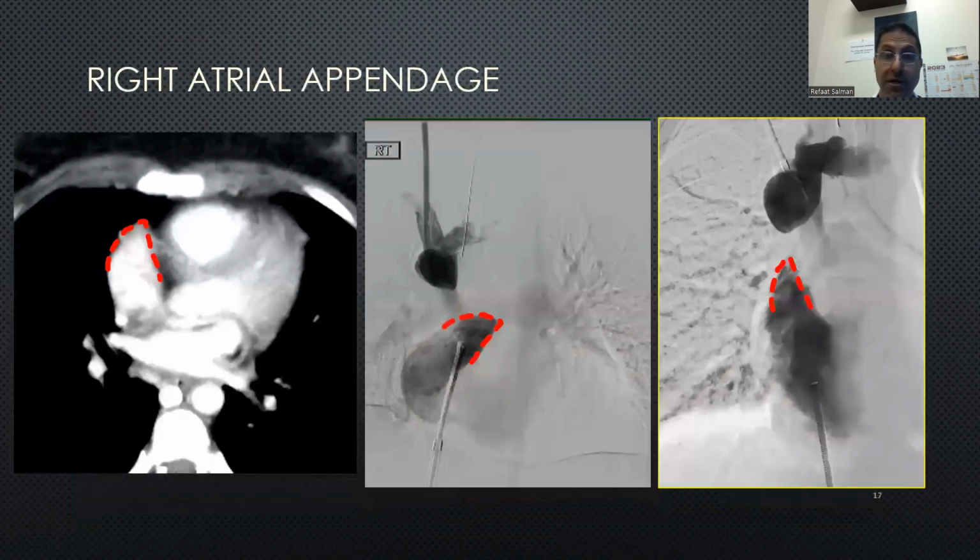It can deceive you on a venogram if you have an obstruction of the SVC. So puncturing it or trying to recanalize from this approach will end up in a disaster. So multiple projections and knowing the trajectory of your needle is very important to avoid it.